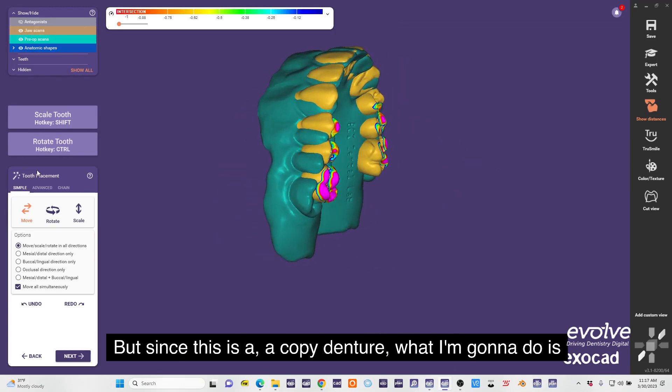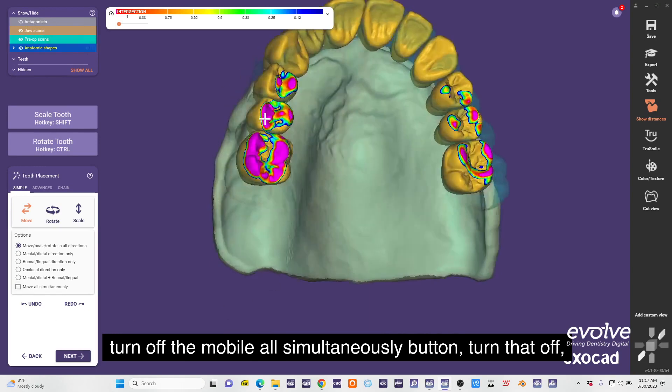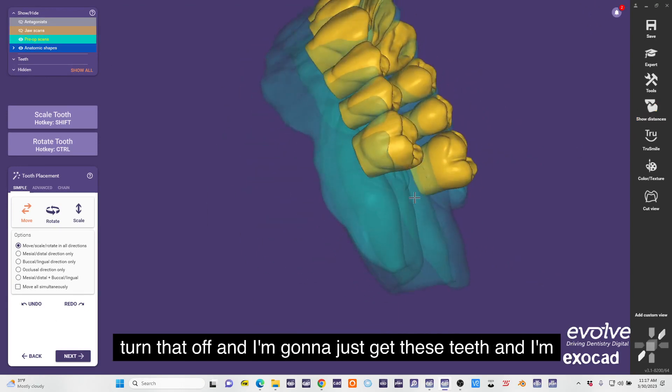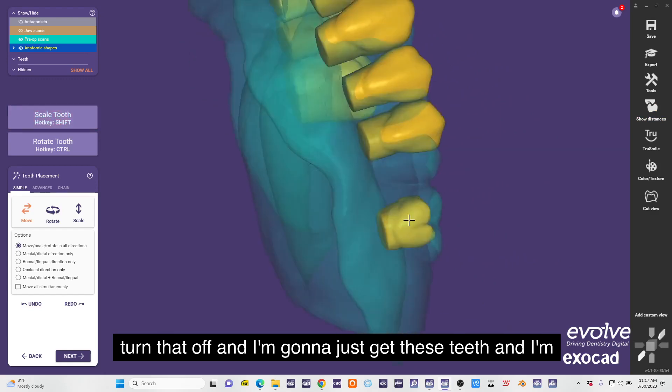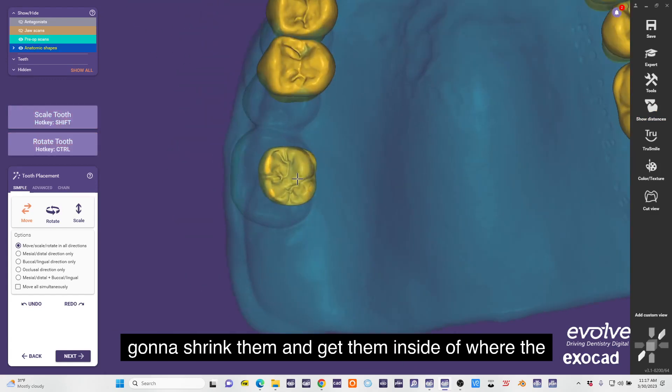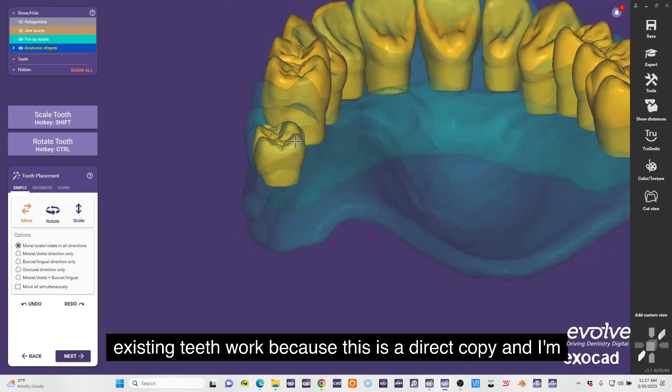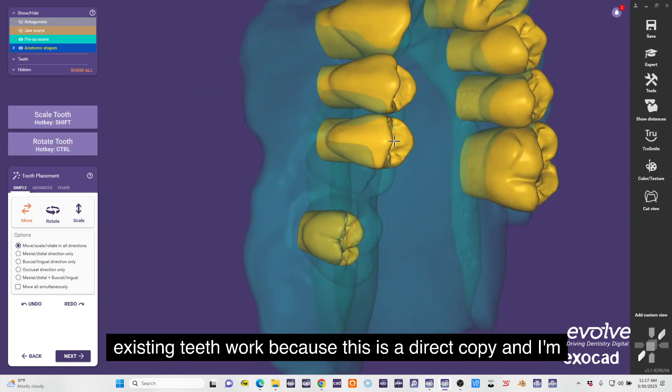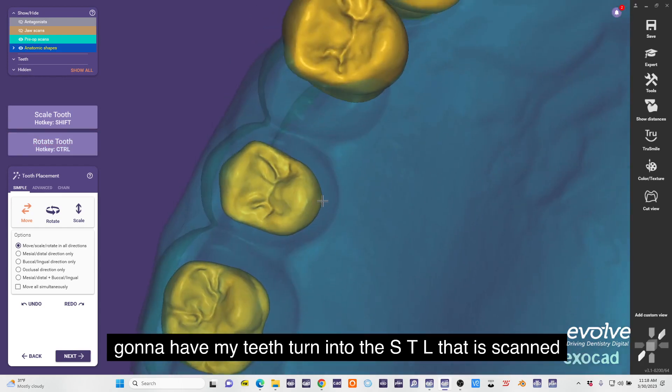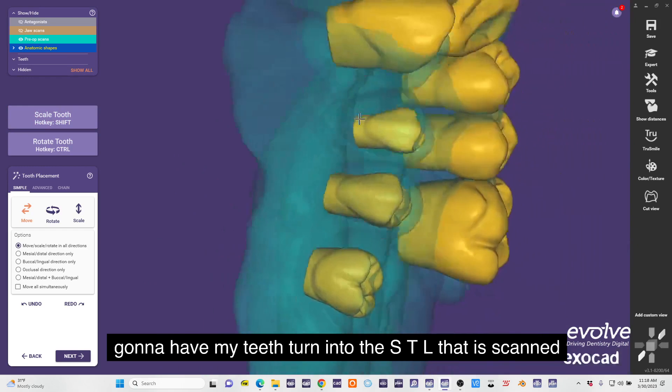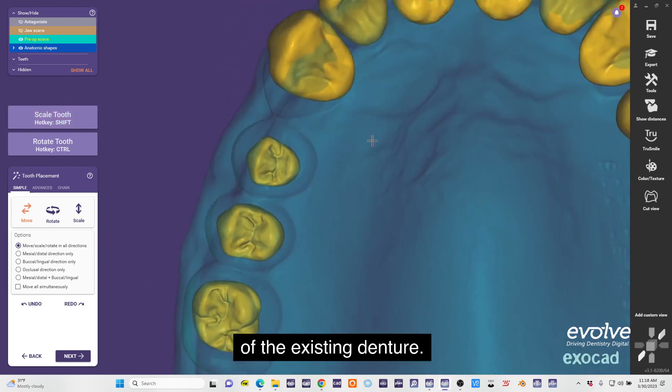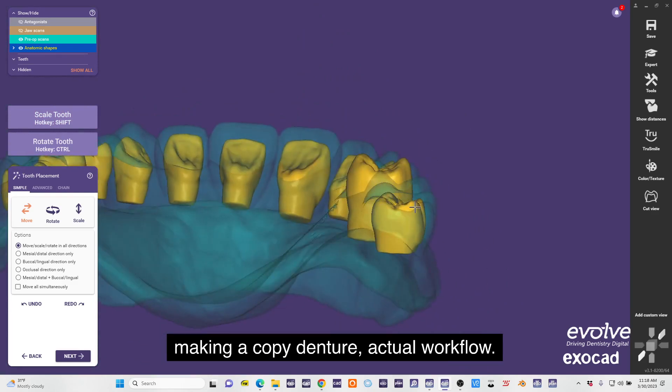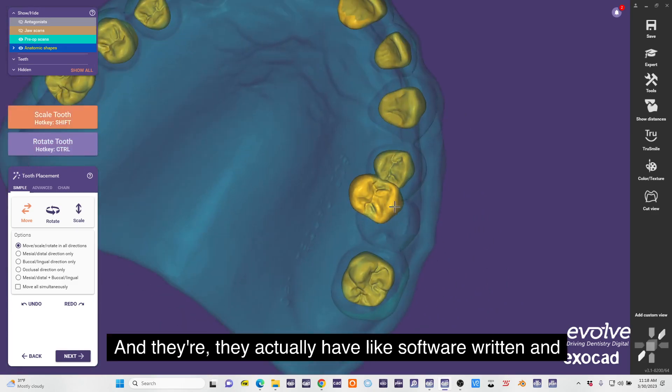But since this is a copy denture, what I'm gonna do is turn off the move all simultaneously button, turn that off, and I'm gonna just get these teeth and I'm gonna shrink them and get them inside of where the existing teeth work, because this is a direct copy. I'm gonna have my CAD teeth turn into the STL that's scanned of the existing denture.